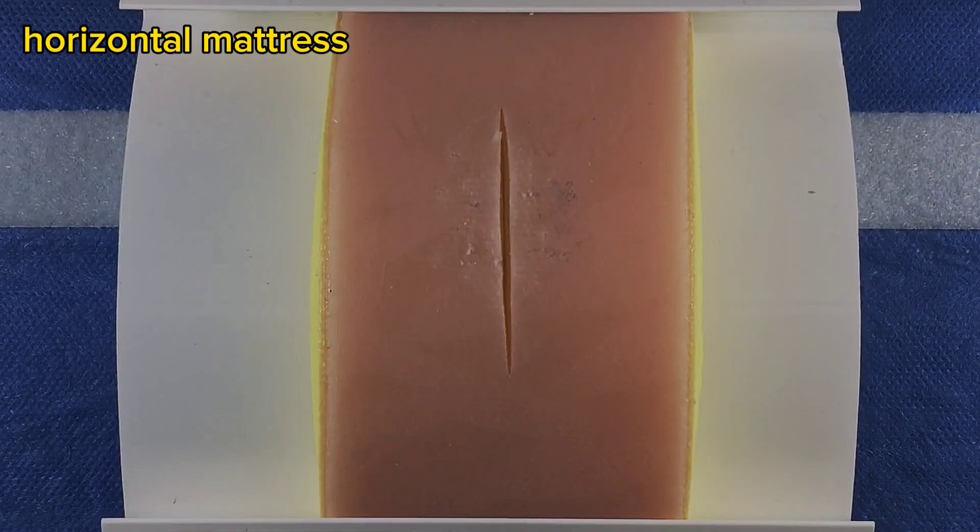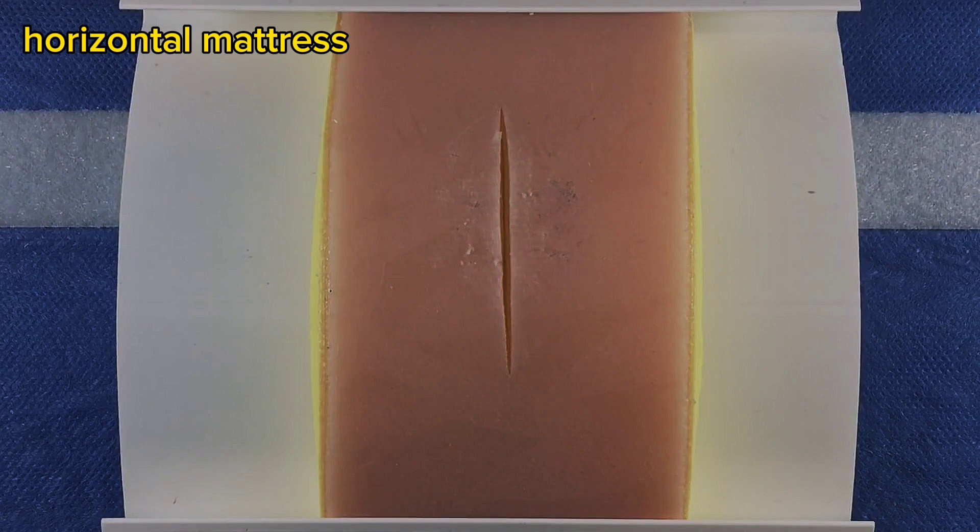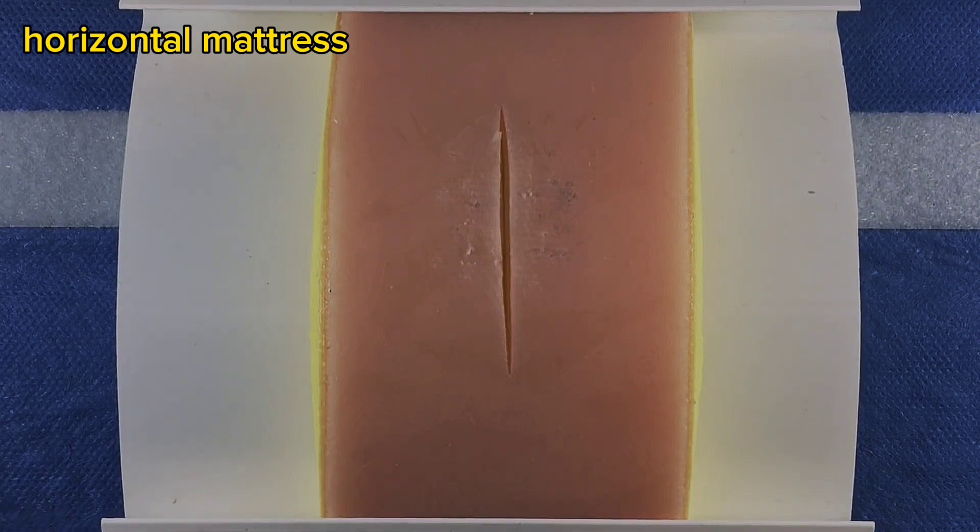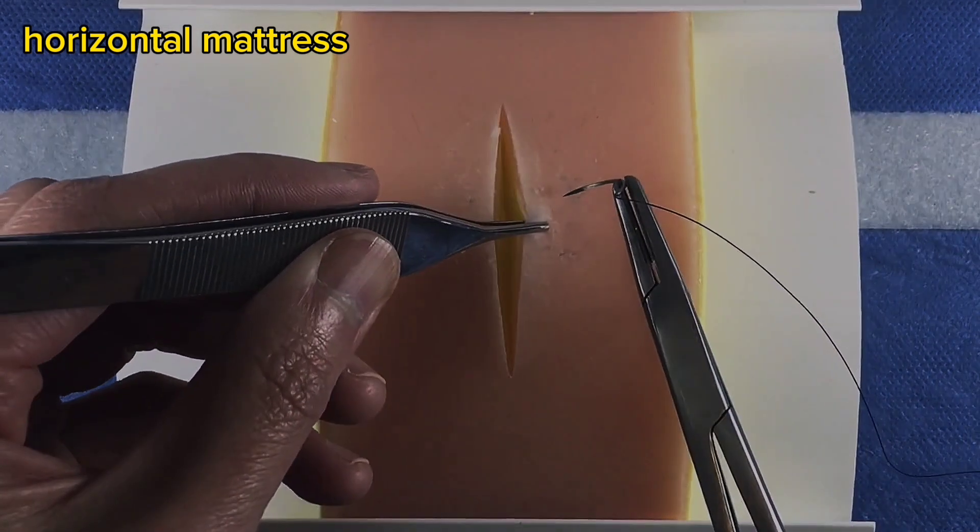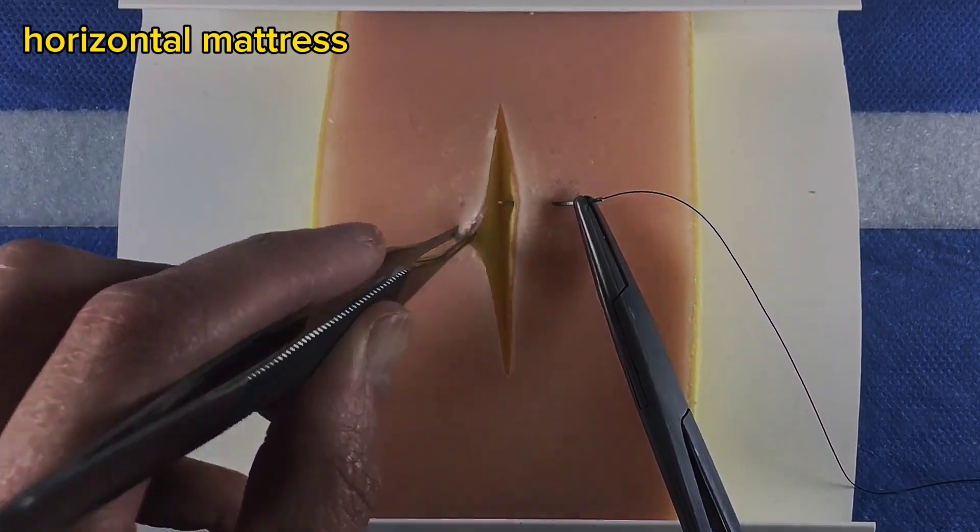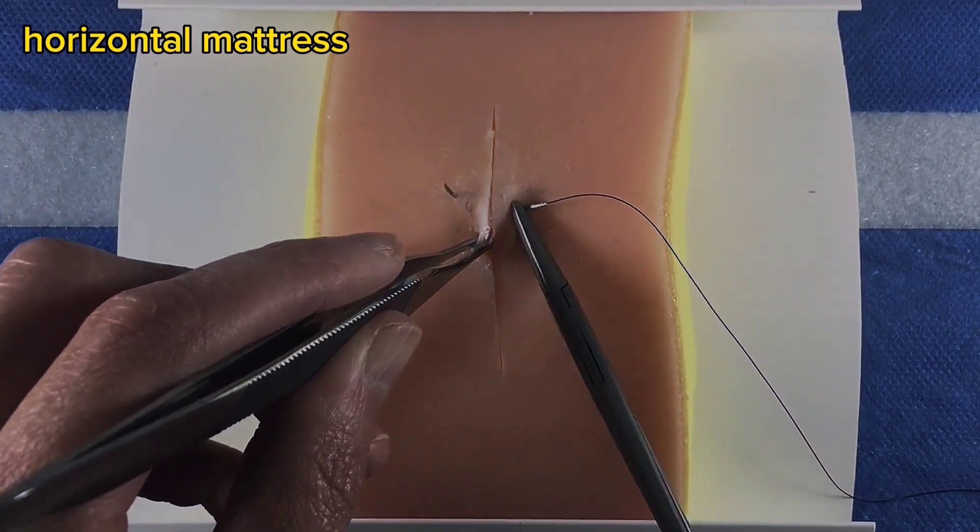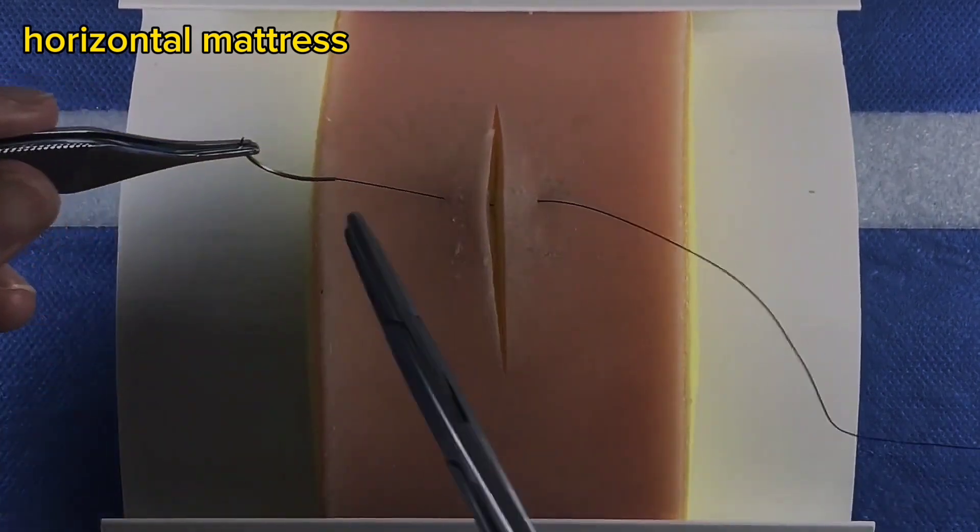A horizontal mattress is where two stitches are placed in the same horizontal plane next to one another. This is ideal for everting the wound edges to facilitate optimal healing. To perform a horizontal mattress stitch, drive the needle horizontally across the wound as you would a simple interrupted stitch.